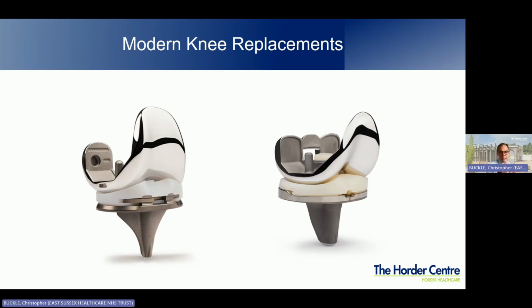And the key things about these, they maintain that respect for the soft tissue structures around the knee, providing more natural and normal kinematics, i.e. the normal movement that you would expect of a normal knee. And they offer the advantages of having the ability to personalize the implant size to the patient, to personalize the size of the bearing surface, so the small plastic piece of material that sits between the two metal implants, to again recreate normal anatomy.